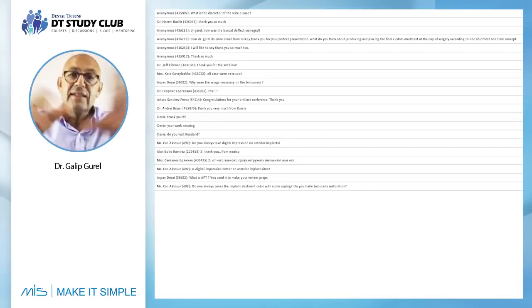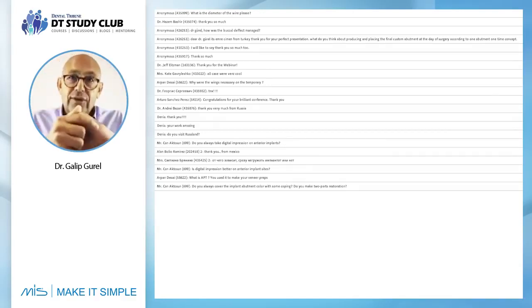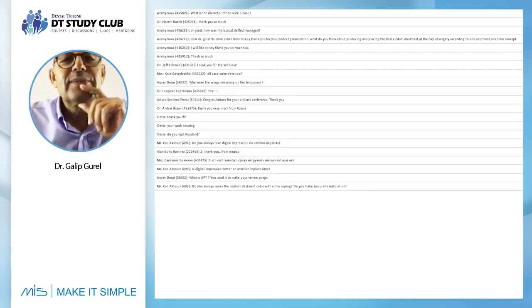And then furthermore, if you take this out of the implant in the mouth, and with the wings, if you seat it on the stereolithic model, then it is in a way transferring everything related to the implants into your stereolithic model. So once you fix the transfer analog into the stereolithic model, it's almost like making the impression of the implant. Once you fix it there, you can always go ahead and cut the wings and further continue. So this is basically why we use the wings. Let's see some other questions.